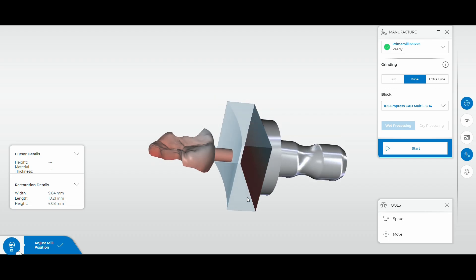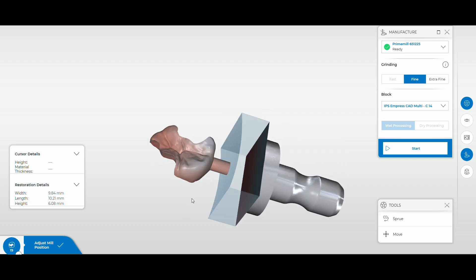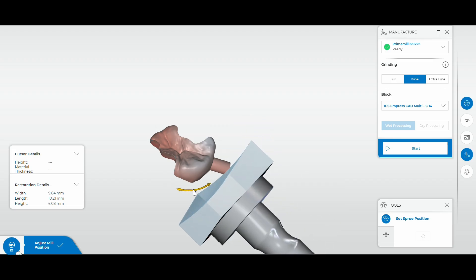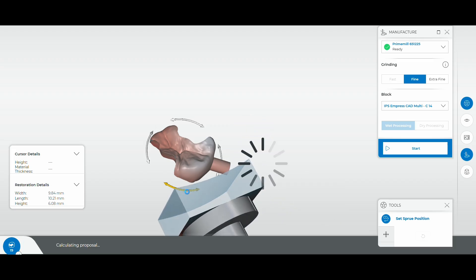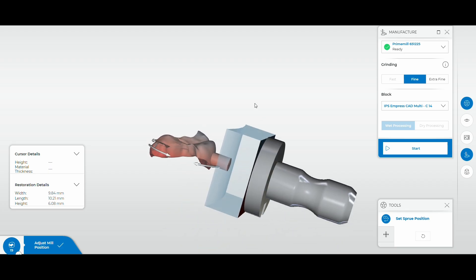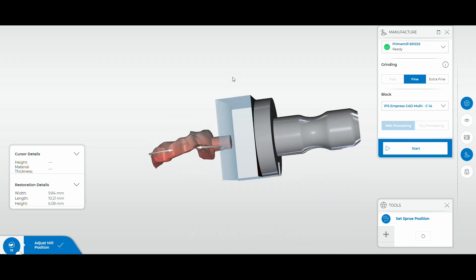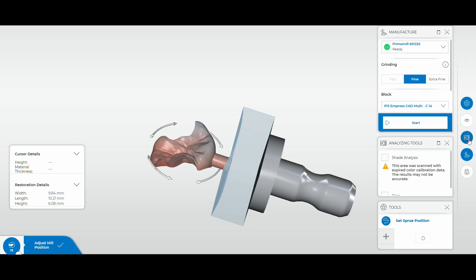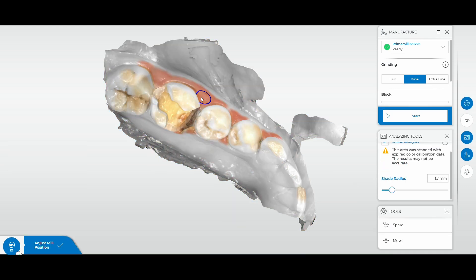This is the restoration — it's going to be milled live right as the patient is waiting, then we're going to deliver it. We started seeing this patient at 8:30 p.m. and delivered this restoration at 9:30. She was walking out of here at 9:30. I'm really happy with the final restoration and how it looked. I can also find out what shade her tooth is using the technology and the scans, giving us an almost perfect shade match to the surrounding teeth in the quadrant.